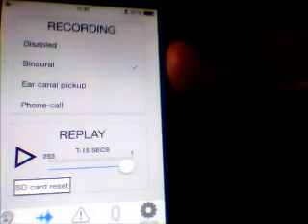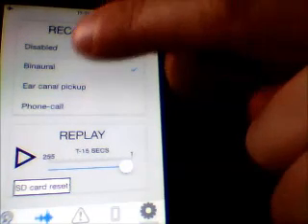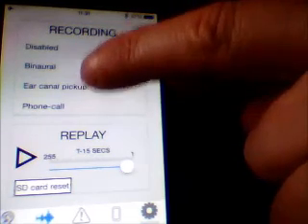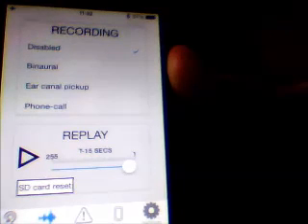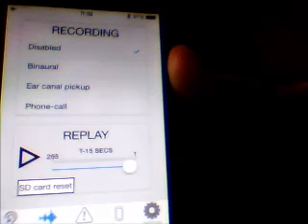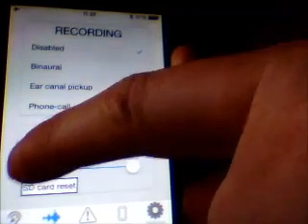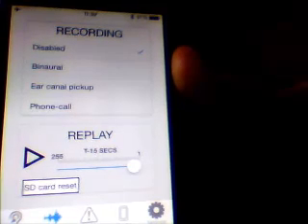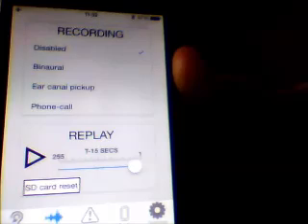Now we are on the second screen, the recording screen. So looking at this menu here, we see the audio recording select menu. This sends a BTLE message to the earphone hardware to configure which audio channels are recorded with the SD card on the earphone hardware. This button here is the start or stop playback button, which sends a BTLE command from the iOS app to control playback of audio from the SD card to the earphones.